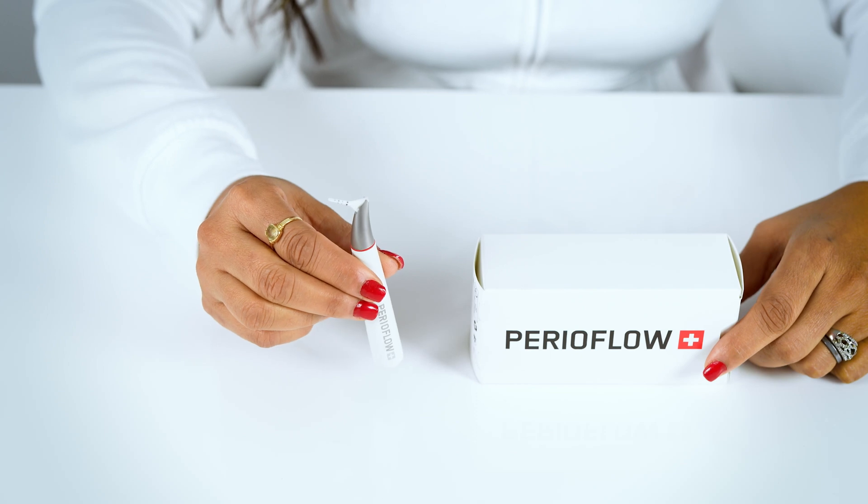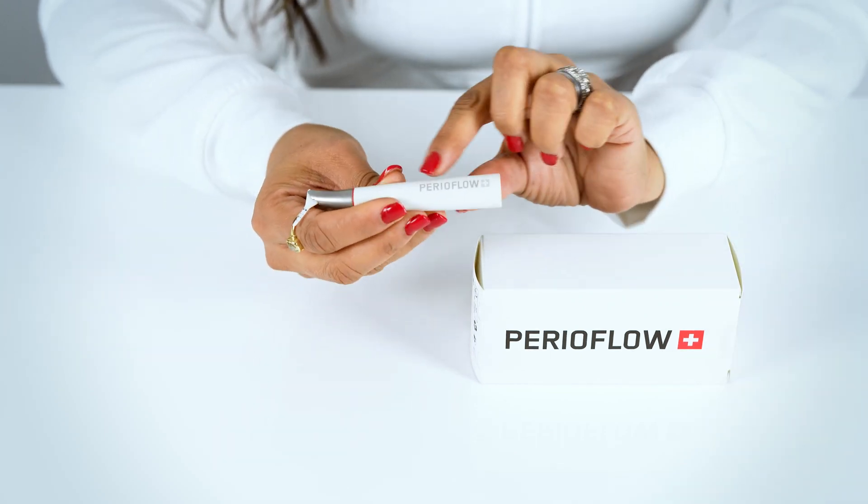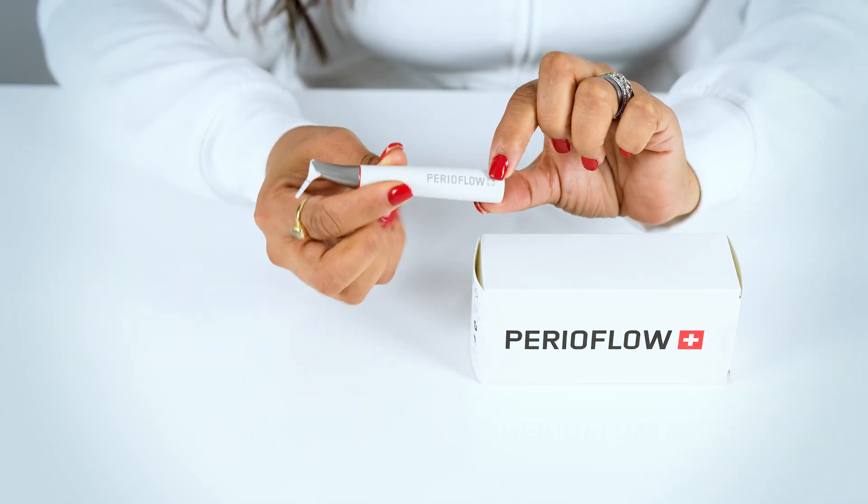Hi, today we're here to talk about the PerioFlow nozzle. This is essentially the fifth step in guided biofilm therapy. The PerioFlow nozzle is to be used always with the PerioFlow handpiece. You will use the nozzle only if you have to remove biofilm from subgingival areas with probing depths from more than 4mm up to 9mm.